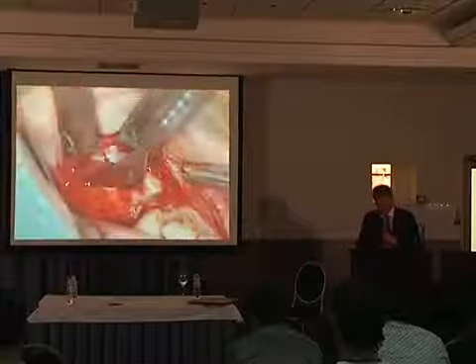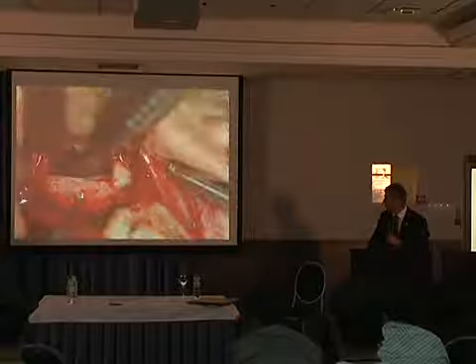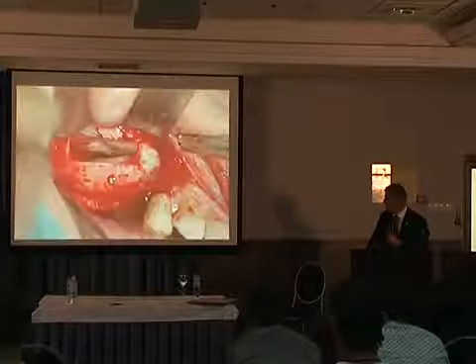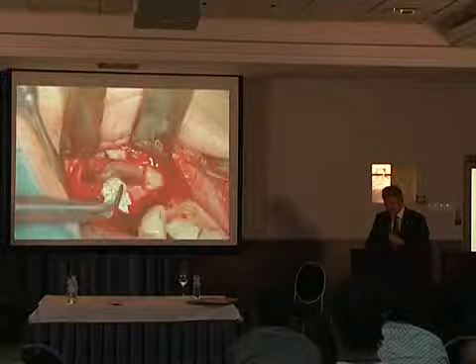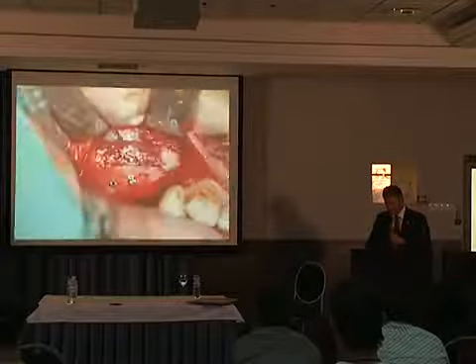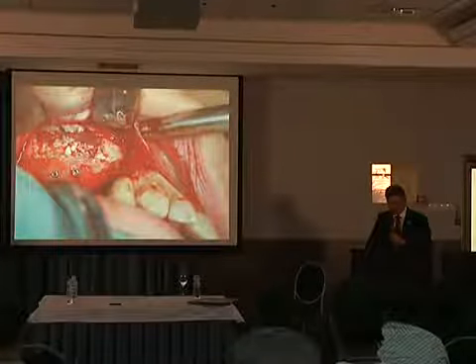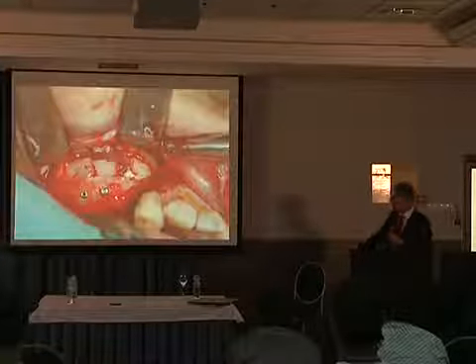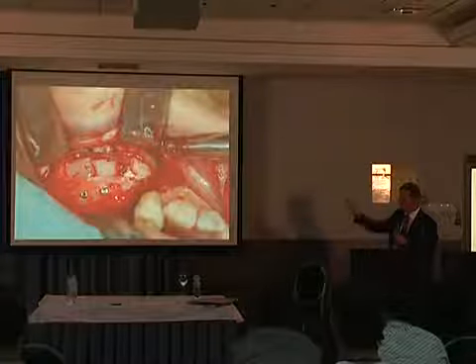Блок снаружи. Fixation of the bone block with a mini screw. Фиксация мини-винтами. Some granulars with PRGF. Теперь the bios again is going, right? Bios, смешанный вот с этой фракцией, идет обратно в промежуток между нижней стенкой и мембраной, то, что осталось после помещения блока.